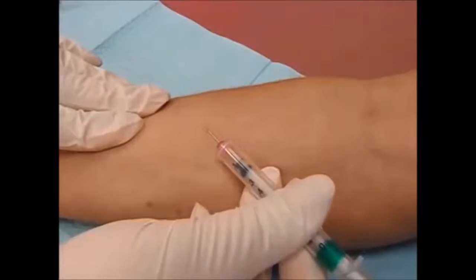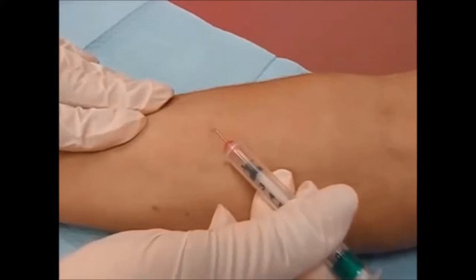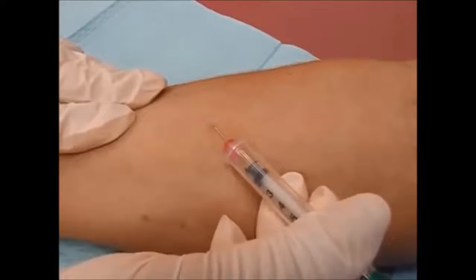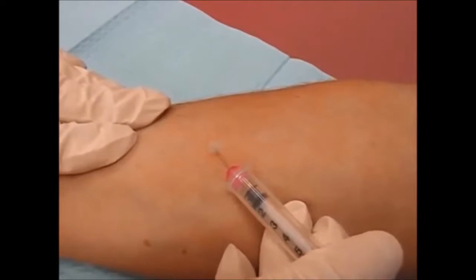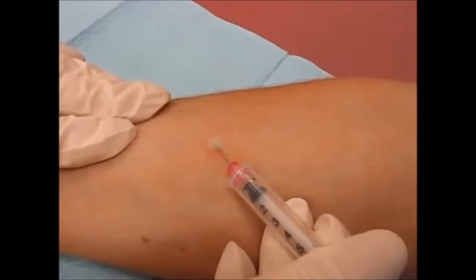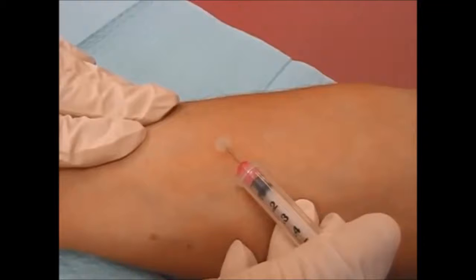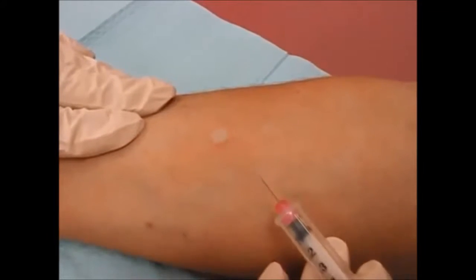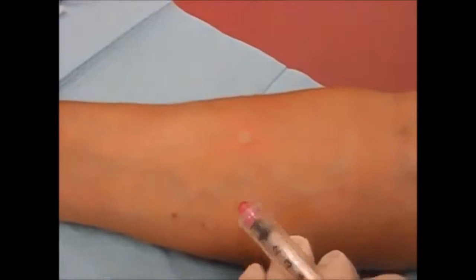Yes. That's going to allow us, as I inject the medication, to be able to form a wheel. As this wheel forms, it's depositing the PPD medication into the skin layers so that it has a chance to react. When all the medication has been deposited, you're going to pull straight out using the same angle of insertion. You can release the tightness of the skin.